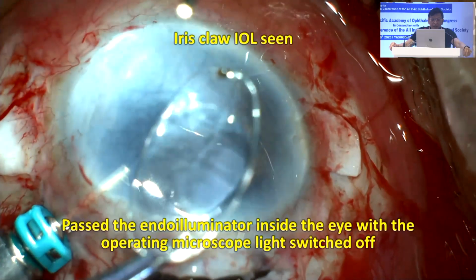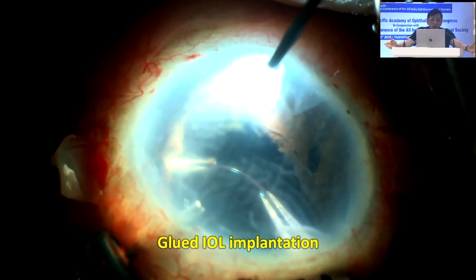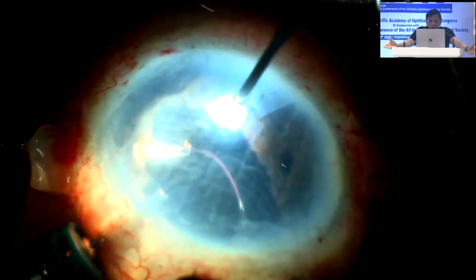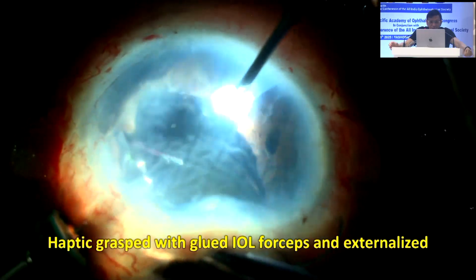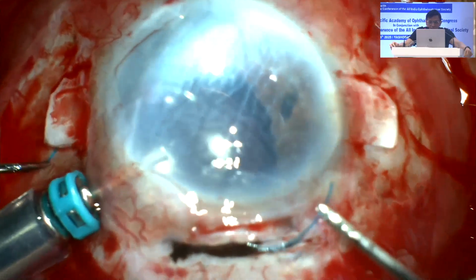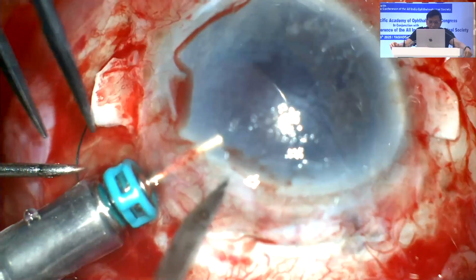Once that's done, now I go to the glued IOL. So why I'm showing you this case is, I already have a large incision. I can use the glued IOL as a non-foldable IOL. I don't need to inject it inside because I already have extended the incision. Catch one haptic, bring one haptic out. Now I go in, do the second haptic. Again, look at the handshake technique which I am doing. Bring the second haptic out.